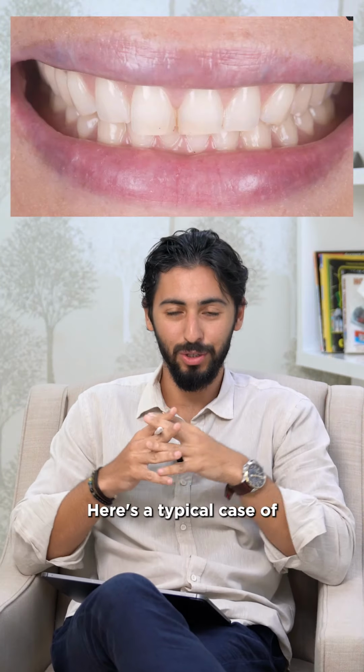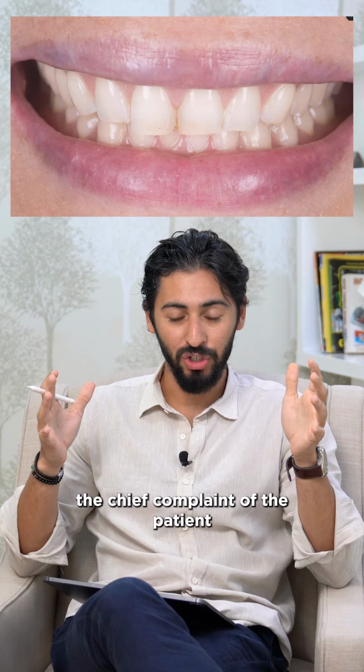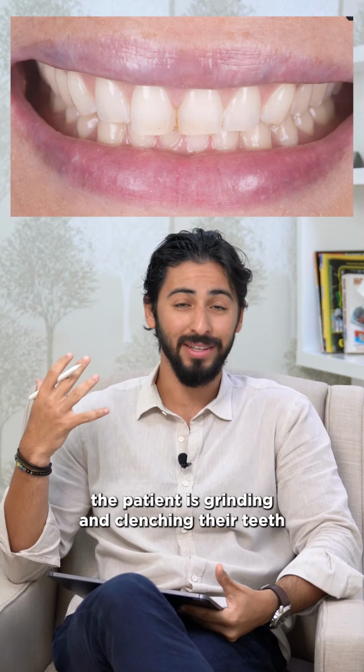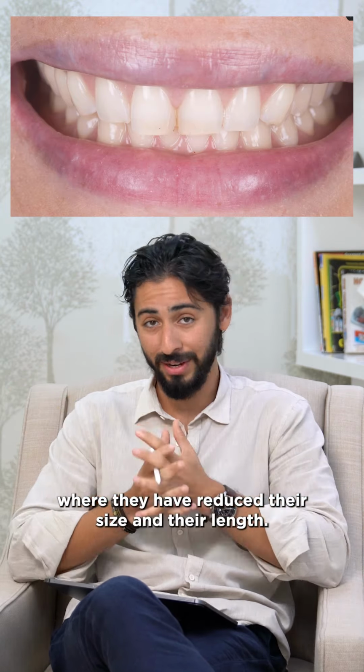Here's a typical case of what we call Prepless veneers. Now, the chief complaint of the patient was simply, "My teeth are short and I want them to show more." And this is one of the main indications that the patient is grinding and clenching their teeth, where they have reduced in their size and their length.